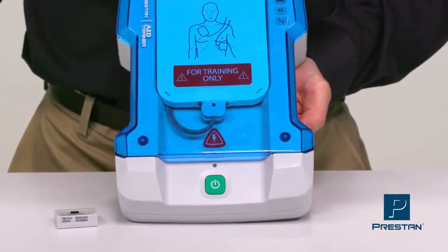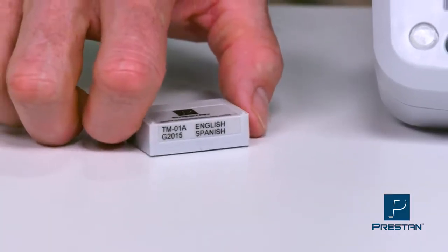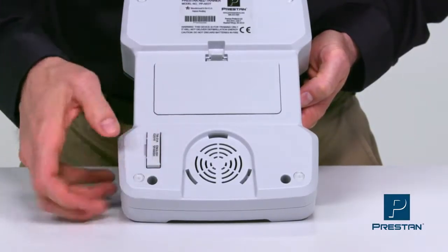The language module contains current CPR guidelines in two languages with clear voice prompts. This replaceable module makes changing language as well as upgrading the software extremely easy.